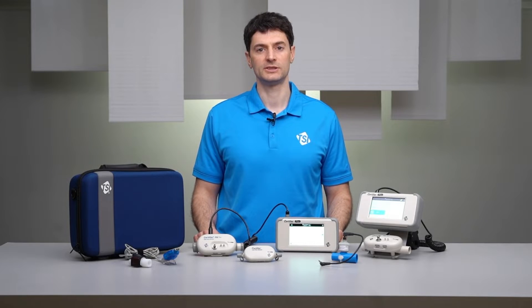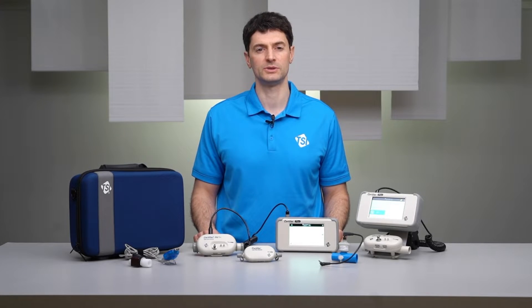The Certifier Plus Flow Analyzer is a portable multifunction test tool that measures gas flows, tidal volumes, pressures, gas concentrations, and more.